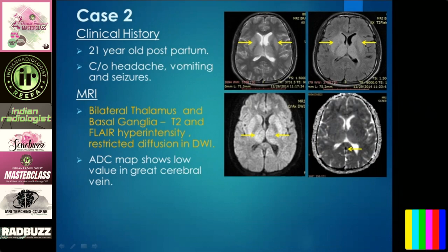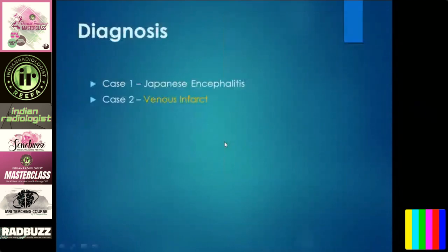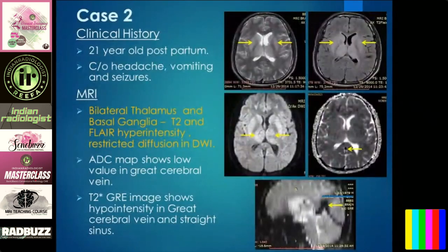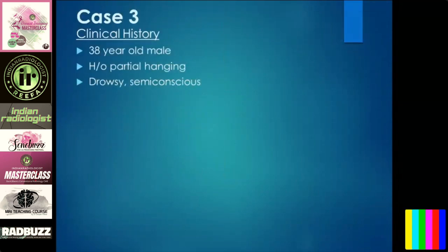Further imaging shows the ADC with a low value in the great cerebral vein. When you see a low value in the great cerebral vein, you need to do an MR venogram. The MR venogram showed hypointensity in the great cerebral vein and straight sinus — a classical case of venous infarct. Whenever you suspect a venous infarct, do T2, FLAIR, and diffusion. When you see low signal on ADC, always do an MR venogram to rule out thrombosis in the cerebral veins.